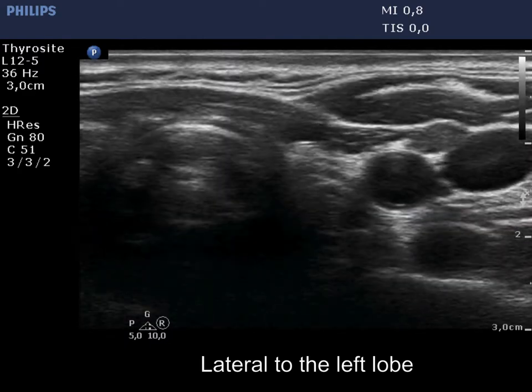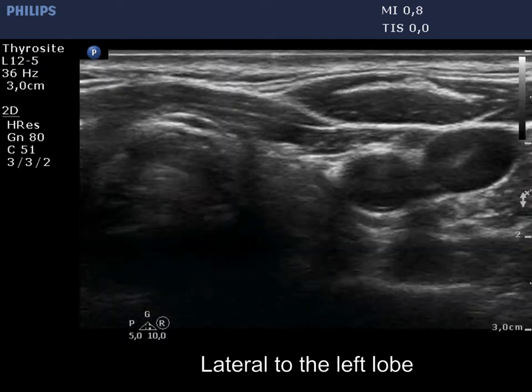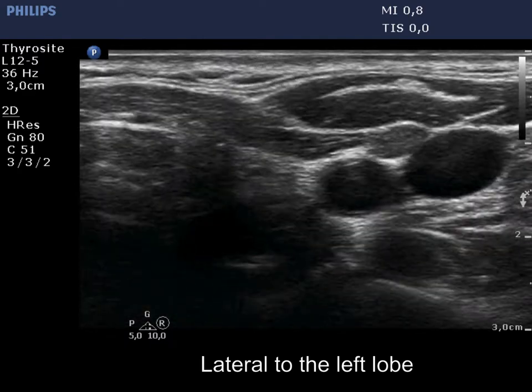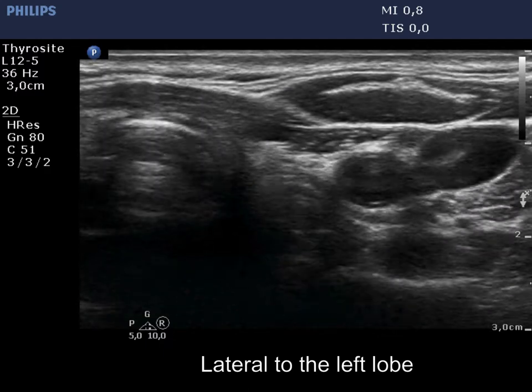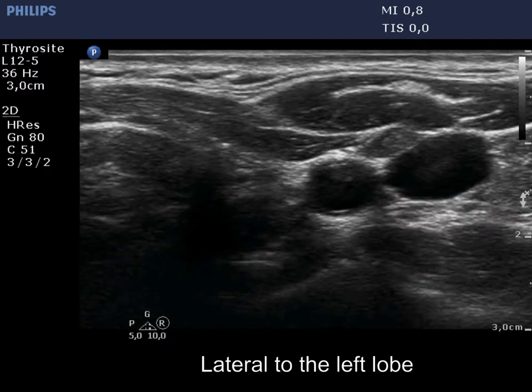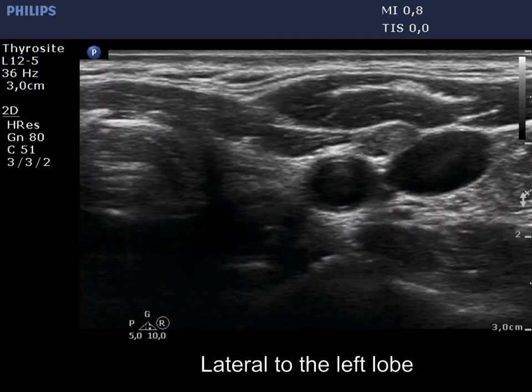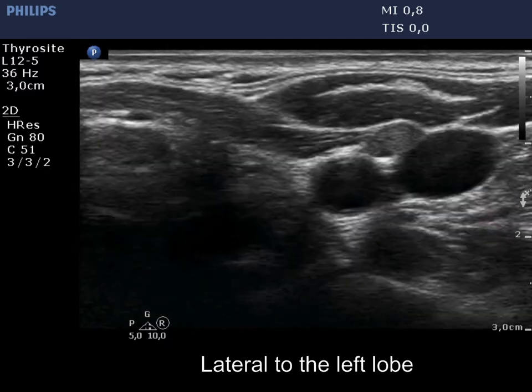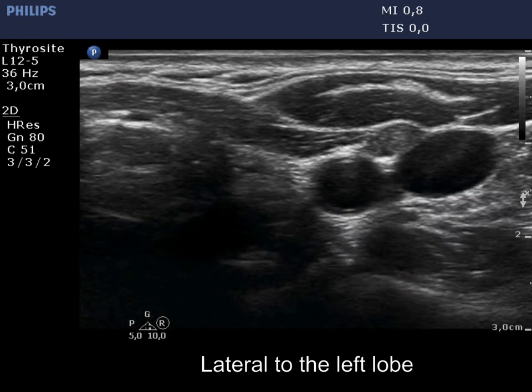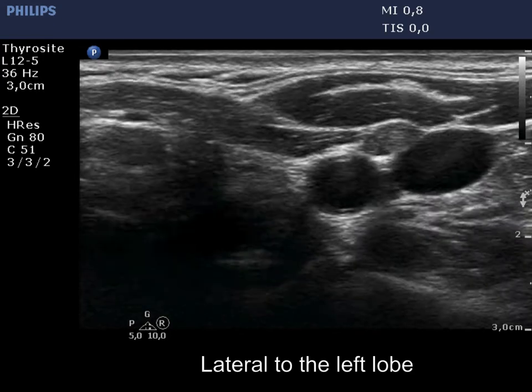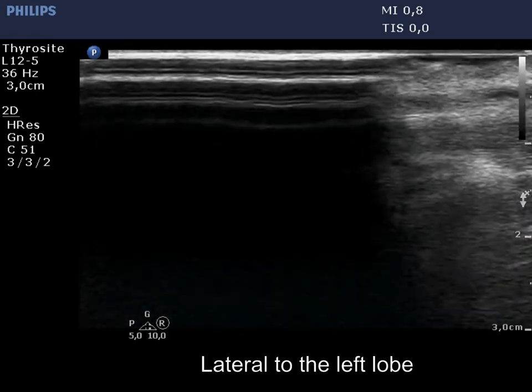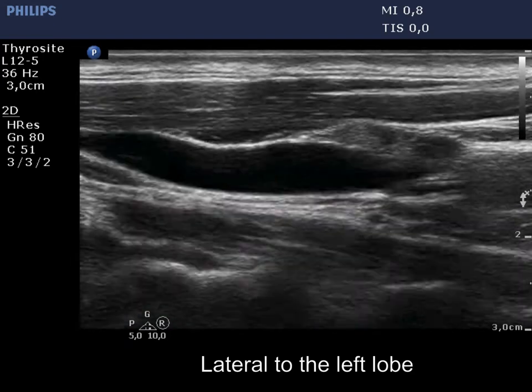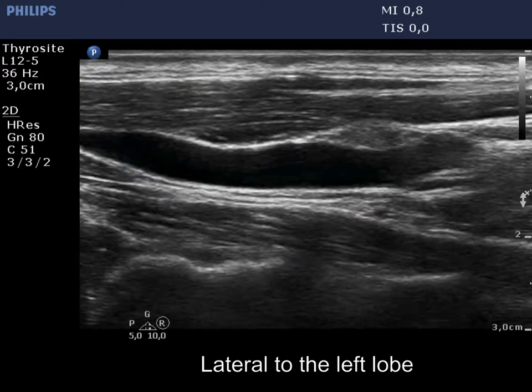There is a small, hypoechoic, inhomogeneous mass lateral to the left carotid artery. The inhomogeneous pattern and the absence of a regular hilum are the features on which this node is more suspicious than the average.